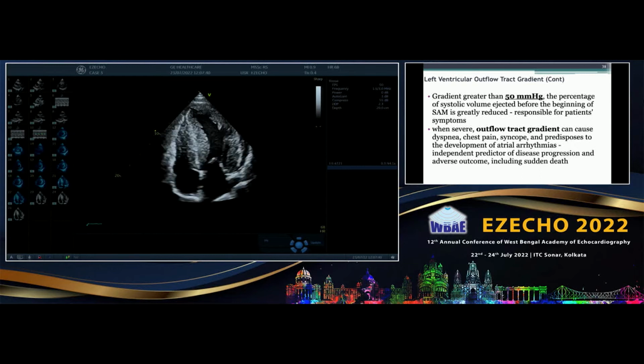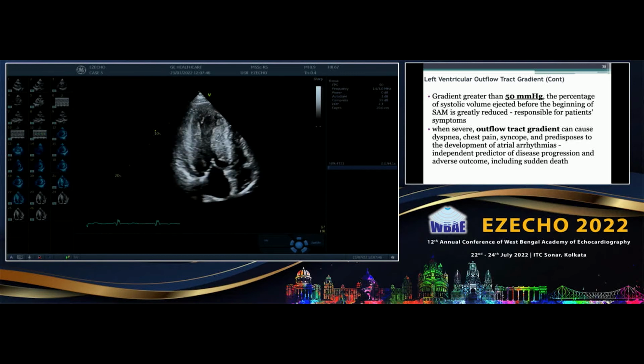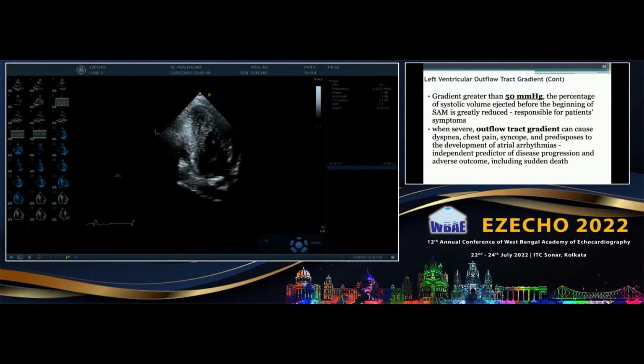I will check that also in the short axis views and all the 3 long axis views. The 2-chamber generally, because in the 2-chamber you can generally see it much better. Go to the 2-chamber also. I think there are some aneurysmal tendencies there. No, I mean, you have to have an obstruction in the mid-cavity.